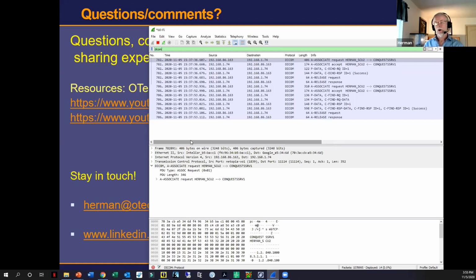You could, if you want to, take a single study instance UID. I can't officially say it's allowed, but you then naturally have the different series, because modality like PT and CT. And by the way, don't use PET, use PT, right? Some of the vendors use PET, which is not a DICOM standard term, and you confuse the heck out of a lot of systems. So you use PT and CT, and you make sure that you have different series for that.